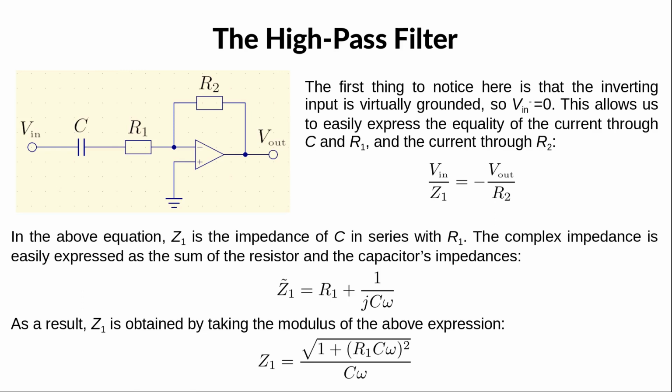So we use here a high-pass filter in order to remove the DC component. For our analysis of this filter, we start by noticing that the inverting input is virtually grounded, so V in minus equals 0. Once again, check my tutorial on OpAmps if you don't know what this means or if you don't know why things are like this.